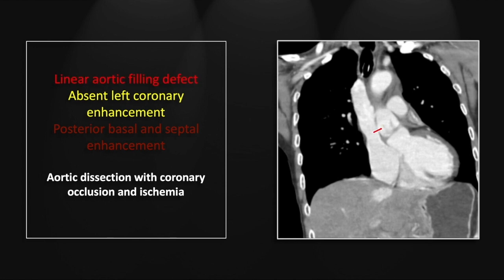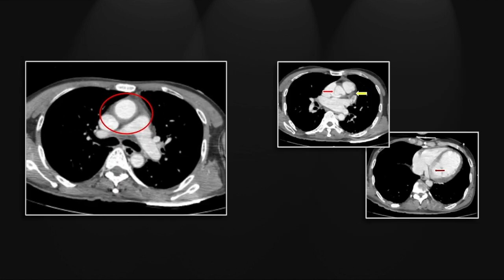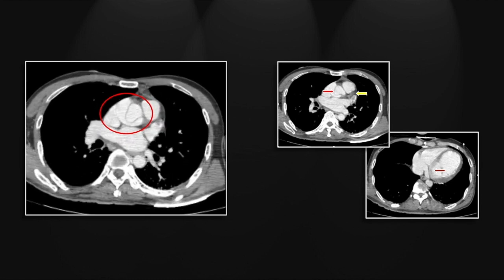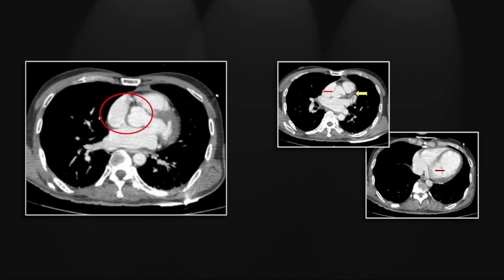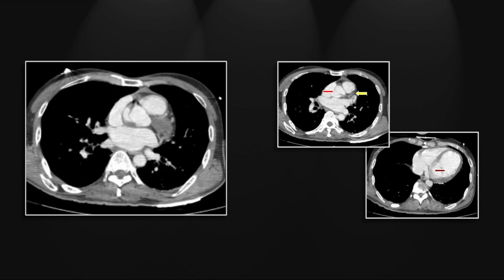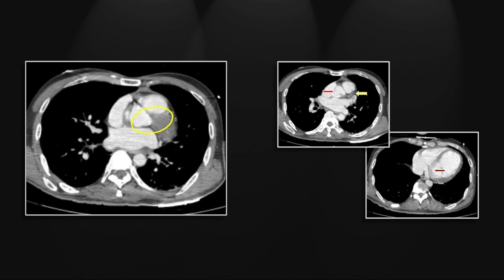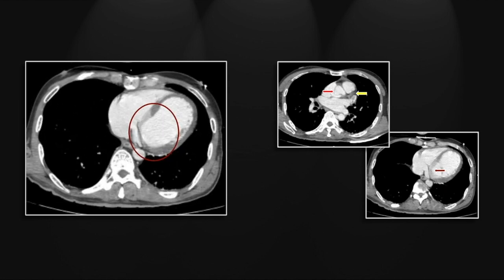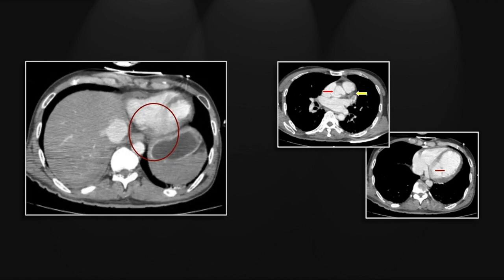On the coronal you can appreciate that linear filling defect well above the level of the aortic valve, and at the left coronary ostium the left main shows no evidence of contrast opacification. There is normal enhancing septal, posterior, and inferior myocardium with the relative hypodense remainder consistent with ischemia. On the cine version of the dissection you can see very nicely that it passes directly across the left coronary ostium.